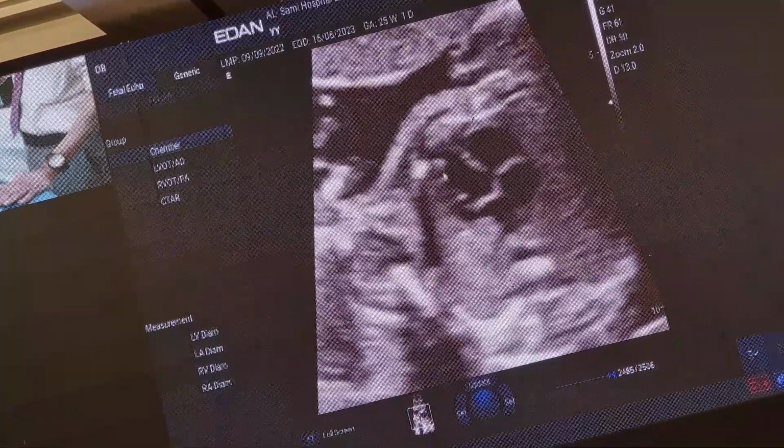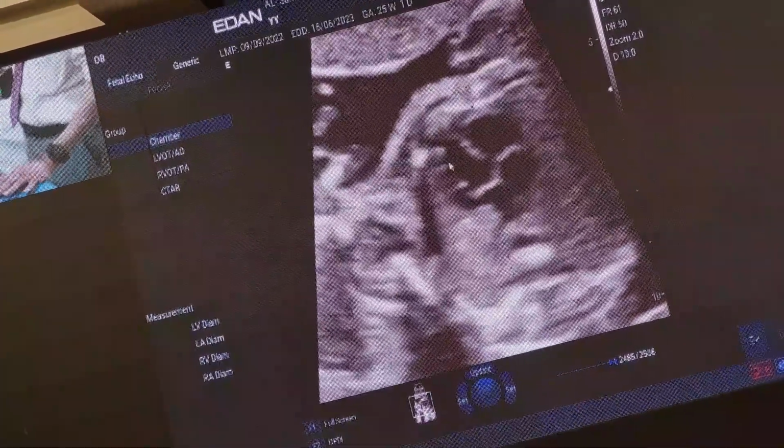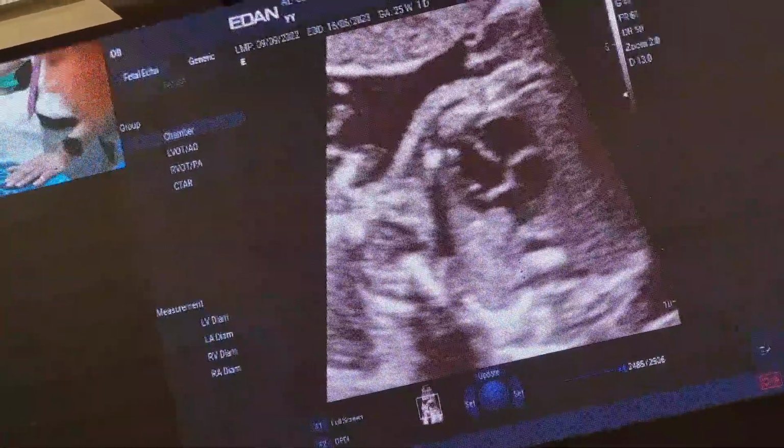This is the left ventricle, which I call clean shaven. Here we have the moderator band, so it's very dirty looking, right? This is very clean looking. Women like men who are very clean shaven, right?